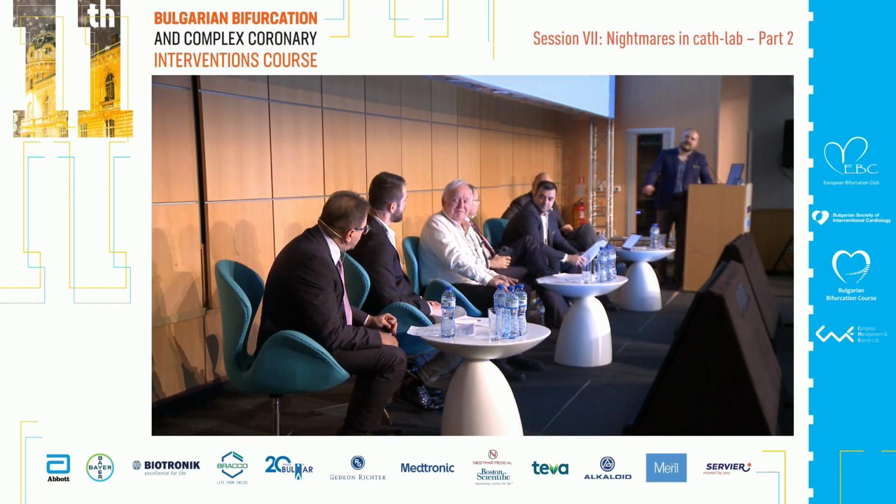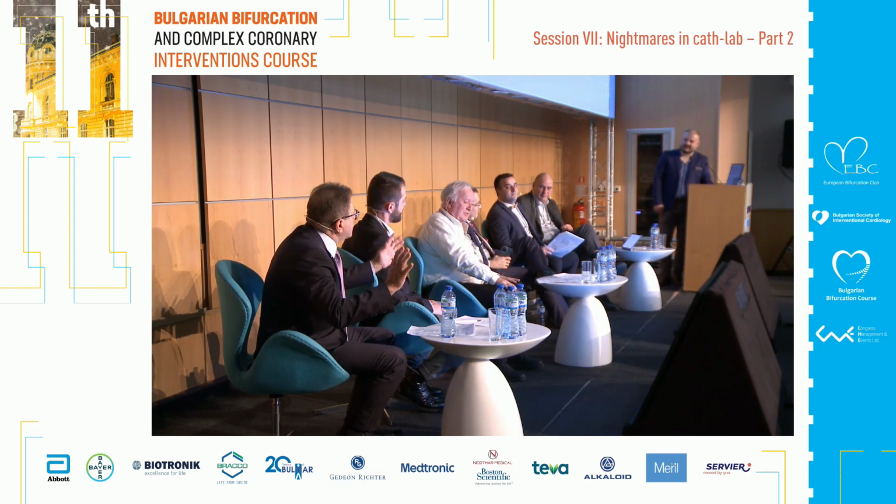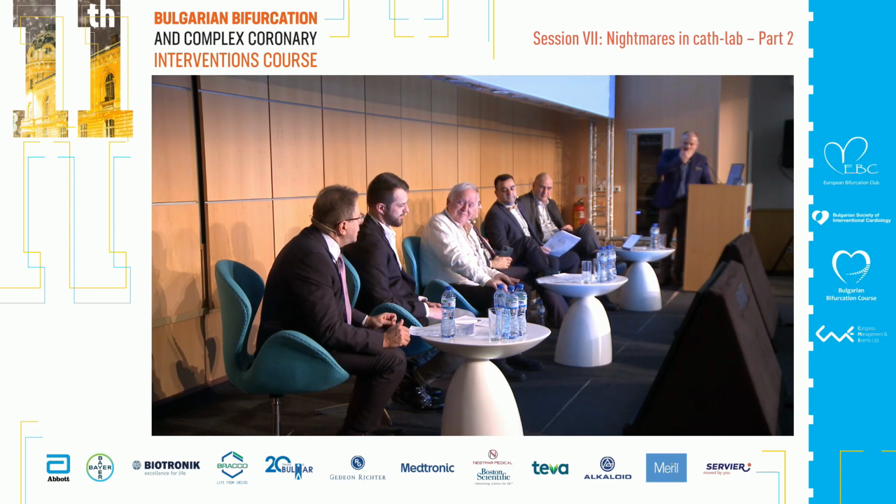Another option would have been to put a drug-eluting balloon. But what for? There was no indication for additional treatment. There was a good lumen, there was no intimal hyperplasia. So I would leave it.